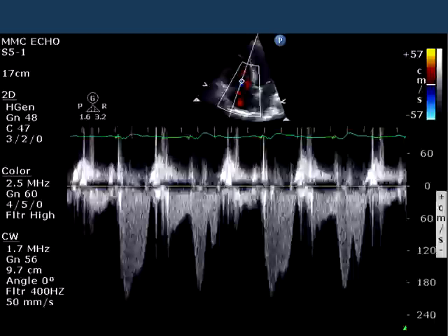Those of you who are familiar with echocardiography will see that this is a continuous wave Doppler signal obtained in the apical four-chamber view through the tricuspid valve. Take a look at it. I now pose the question: what are we seeing here?